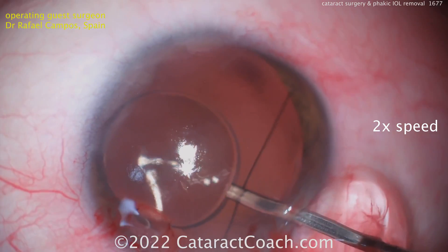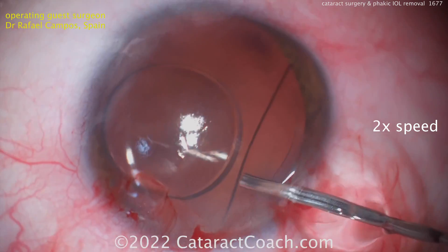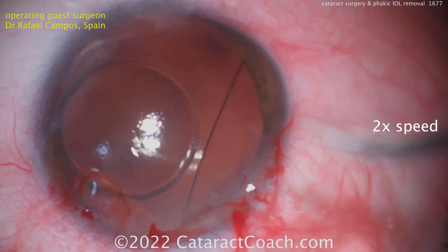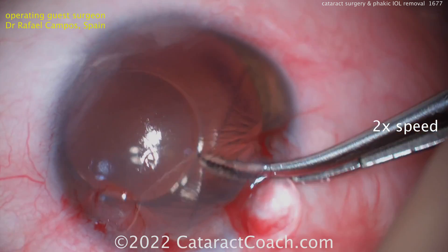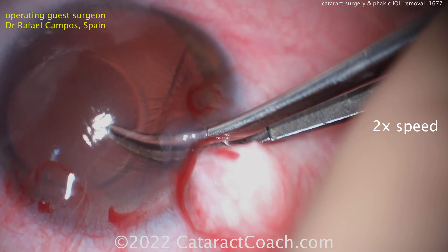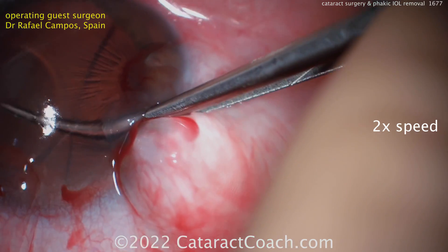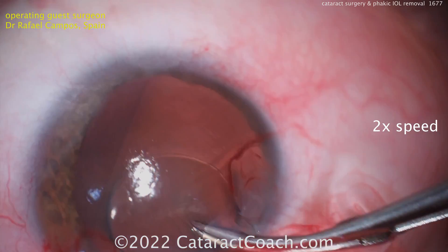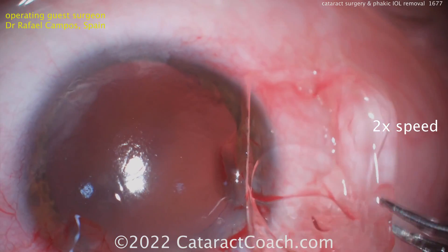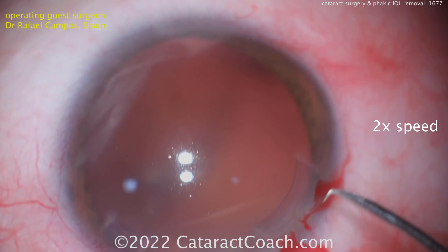But it's flexible enough, and very thin, that you can actually pull it out of the eye. You want to get some good forceps that have a grip on them — usually that means serrated, but you can use a straight or smooth one here too. Get across it as much as you can and it'll fold on itself. I like to rotate the lens 90 degrees from that angle.